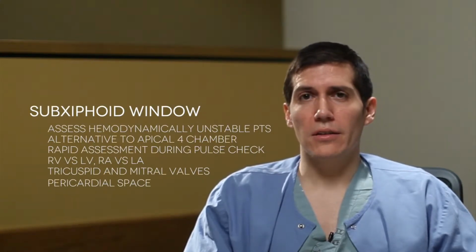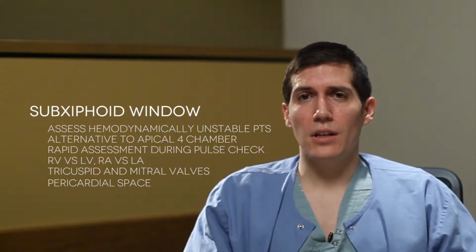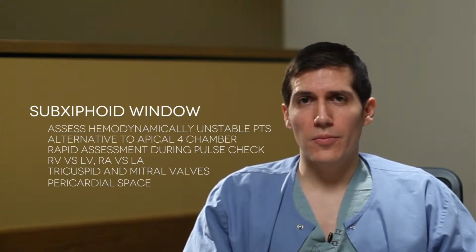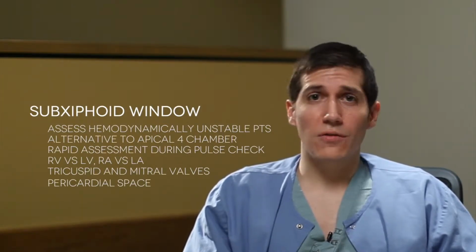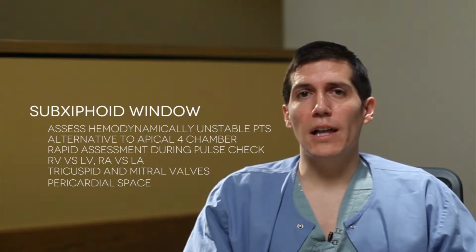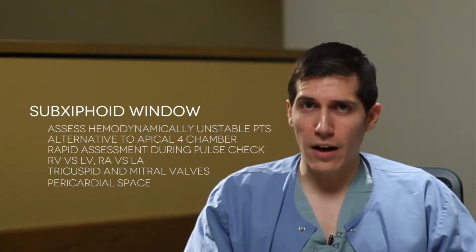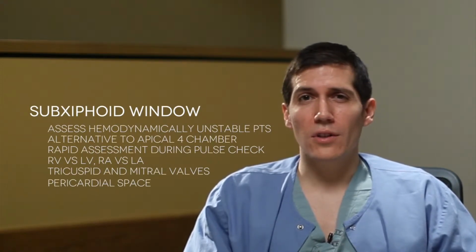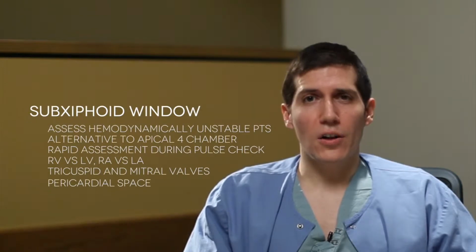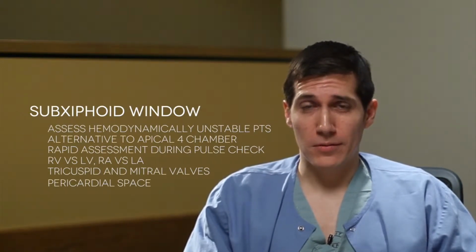Another special thing about the subcostal or subxyphoid window is that you can focus on the right atrium and then rotate your probe 90 degrees to assess for the IVC, or inferior vena cava. And this will allow you, in the context of knowing what your right ventricle looks like versus your left, to make some qualitative assessment of volume status, or how dry your patient may be.